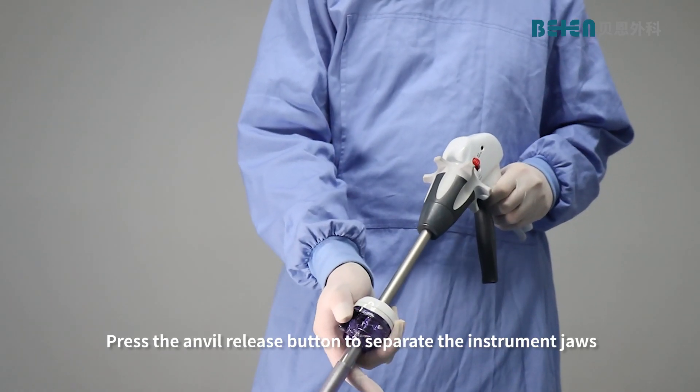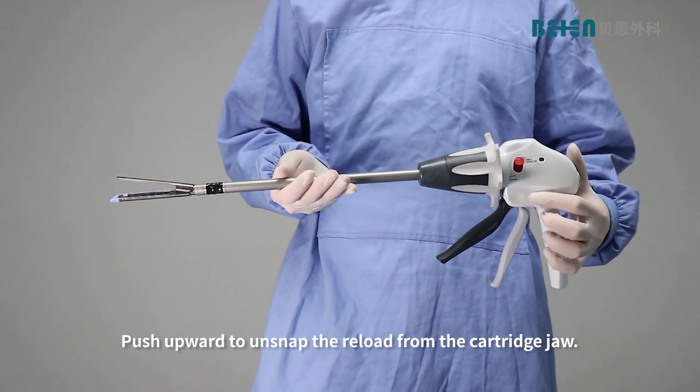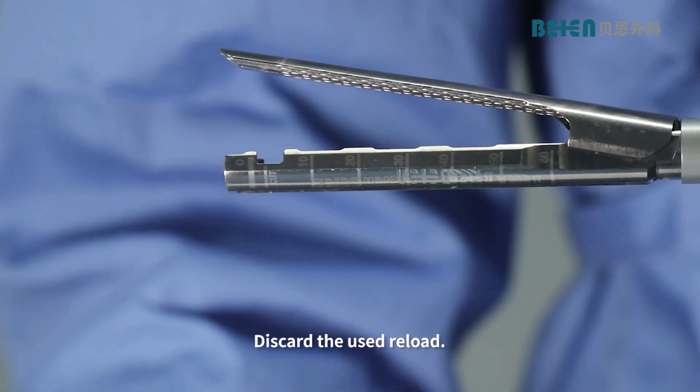Press the anvil release button to separate the instrument jaws. Push upward to unsnap the reload from the cartridge jaw. Discard the used reload.